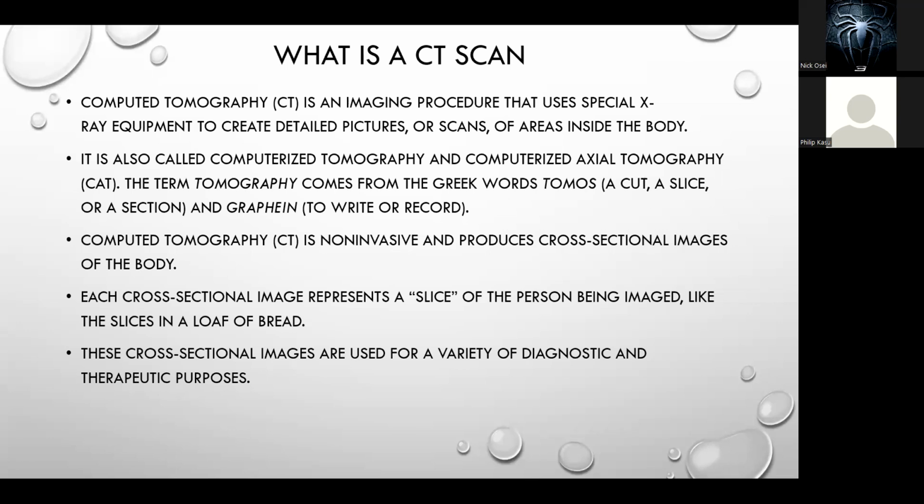And so it's a non-invasive procedure or test, and it produces cross-sectional images of various parts of the body. You are able to image the whole body in just a few minutes. Each cross-sectional image represents a slice of the person being imaged, just like you get slices of a loaf of bread. So we largely have therapeutic and diagnostic purposes.